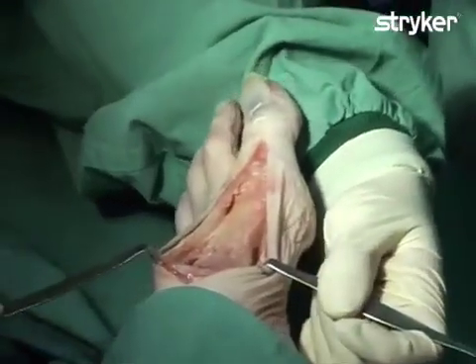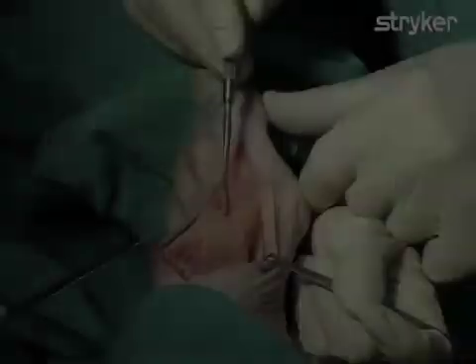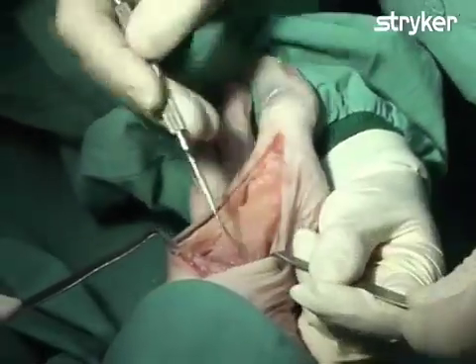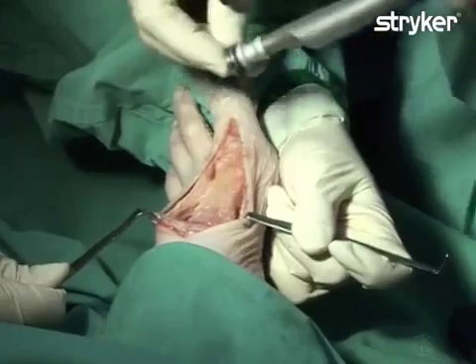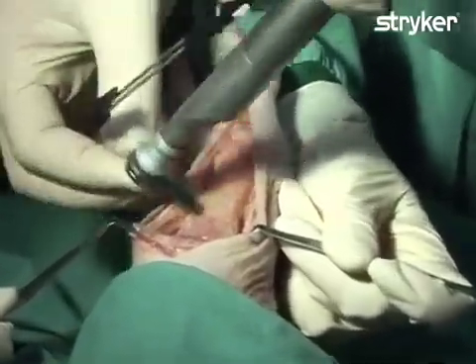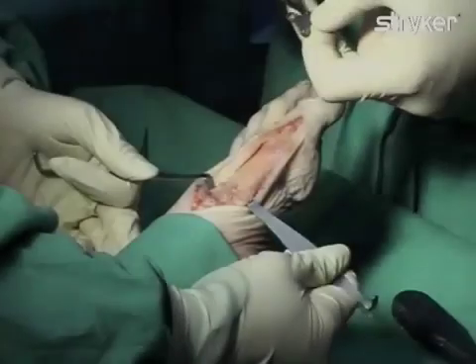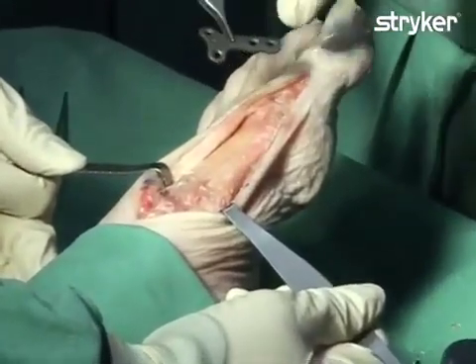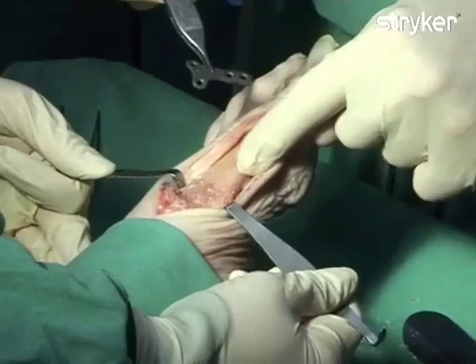The fusion site is now completely closed and the first ray is in a correct position. To add to the stability already provided by the ASSIS III screw, we will now implant a Variax Foot oblique T-plate. A small amount of bone will be shaved from the medial surface of the metatarsal cuneiform joint to aid with plate placement. The head of the plate will be placed on the cuneiform and the tail on the metatarsal. The plate is pre-bent in a plantar direction, corresponding to the plantar positioning of the first ray.